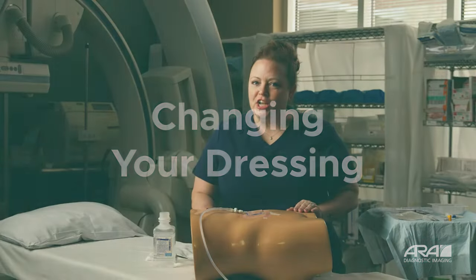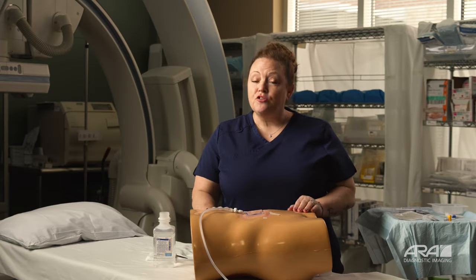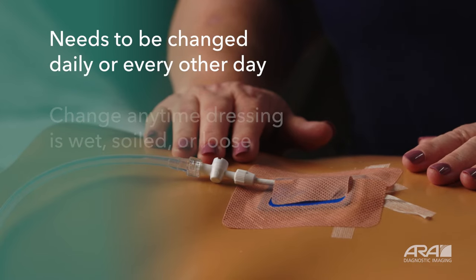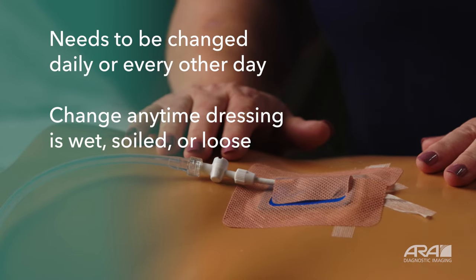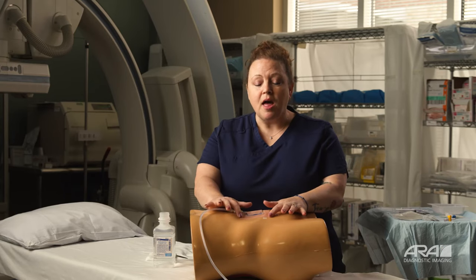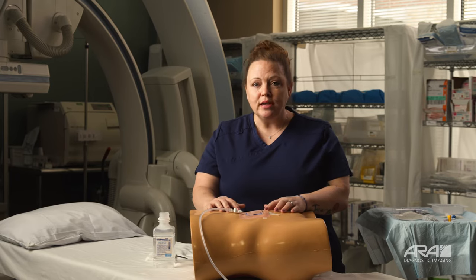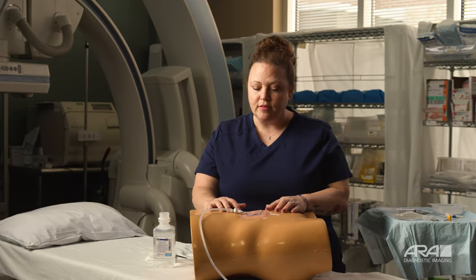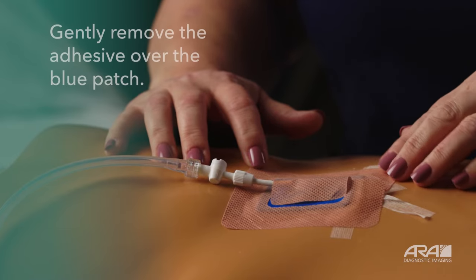Let's talk about changing your dressing. Your dressing will need to be changed every day or every other day. Your dressing should be changed anytime it is wet, soiled, or loose around the edges. When you come home from the hospital or clinic, you're going to notice your dressing is probably a little different than what you have to work with. Let's talk about removing this dressing.